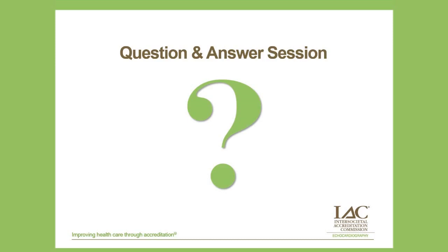Okay. Kaylee asks, how do you quantify MR in AFib or A-flutter patients? It's much more difficult, and where we really see this is when we're asked to do a TEE cardioversion in a patient in AFib whose heart rate is going pretty fast, and we'll put the TEE probe down, and sometimes it looks like terrible MR, and then we cardiovert them, and we look again, and the MR is either completely gone or is mild.